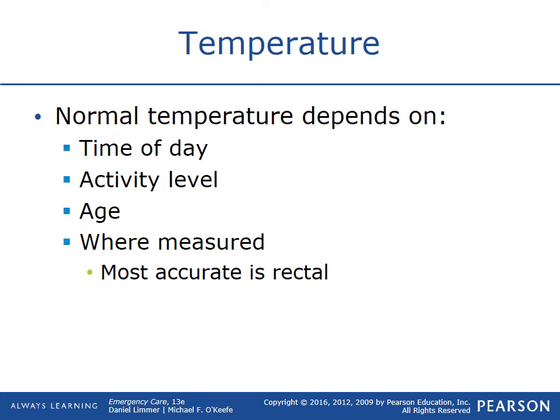Measuring the temperature, knowing what activities and everything go into that, their age, anything else that's going on, and where that temperature was obtained at. Now, there are the different head scanners, the laser pointer ones, but the most accurate way is a rectal temperature. Now, that's not something we routinely do on the ambulance, so don't get freaked out. You don't have to know how to take a rectal temperature, but most of the time we do it in the armpit or in the mouth, and most generally we're worried about taking a temperature on pediatrics because fevers in little kids is what we worry about more so than a fever in an adult.